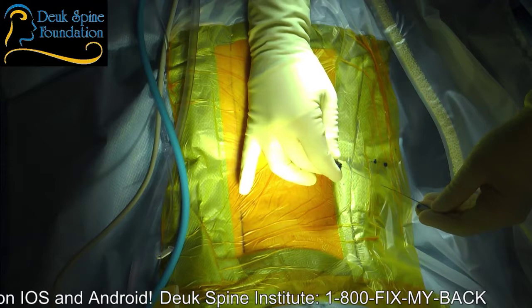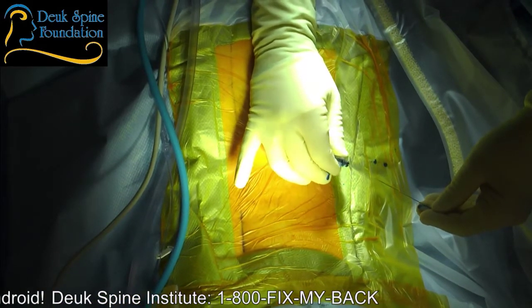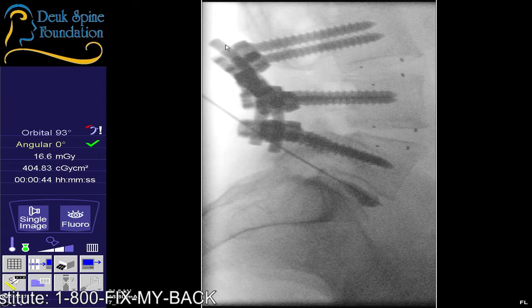All right, I'm going to take the needle out, leave the guide wire in. There's a technique for that. It's twisting and then holding the guide wire stable. Shot, you always want to check and make sure you're not moving the guide wire in or out. This is endoscopic surgery, folks. I did not create endoscopic spine surgery. I just perfected it. And the reason I perfected it was, of course, the technique.